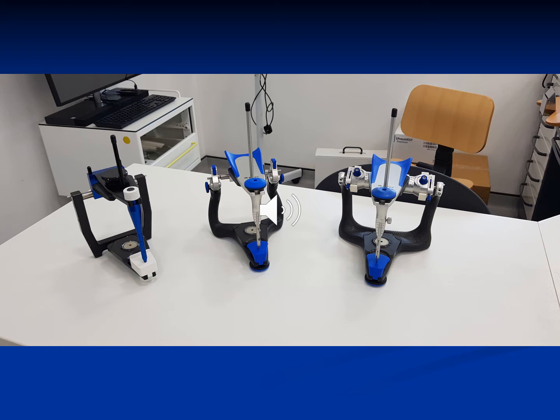Here the condylar element or condylar guidance angle can be changed in both vertical and horizontal directions. And on the right we have an articulator that can be further adjusted to resemble more or less a fully adjustable articulator, even though, as described before, no articulator is 100% fully adjustable to the degree that it will represent the mandibular movement to the tiniest detail. However, it resembles it closer than the ones to the left.